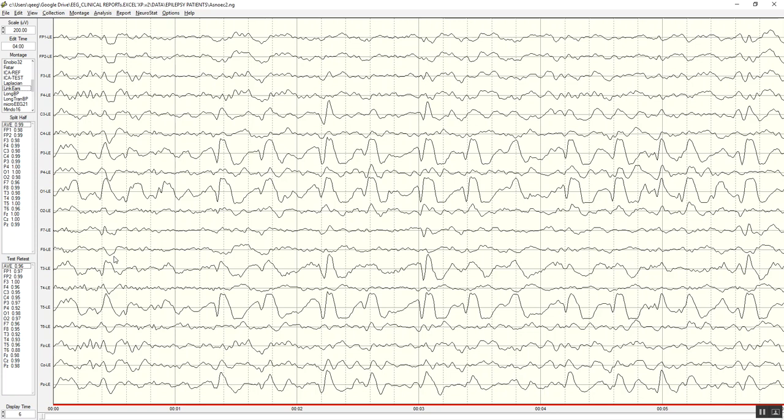Now, there was a complete workup of her at Massachusetts General Hospital with 128 channel EEG, with PET scan, and with high-resolution MRI. And the neurosurgeons had a very good view or understanding of the extent of the epileptic foci. So my job was really not so much to deal with the neurological foundation of the epileptic foci, but rather the healthy right hemisphere. But for purposes of demonstrating the utility of the NeuroNavigator for raw score evaluation of gross neurological dysfunctions, such as this epileptogenic event, I'm demonstrating that here.